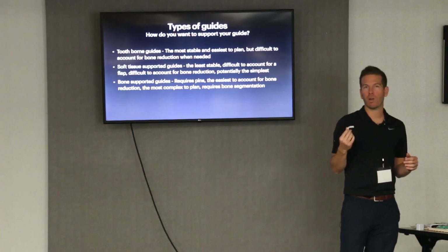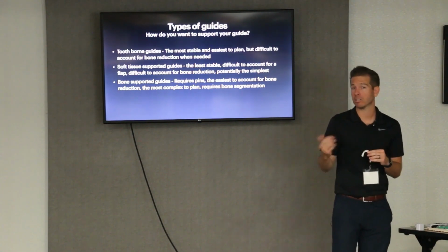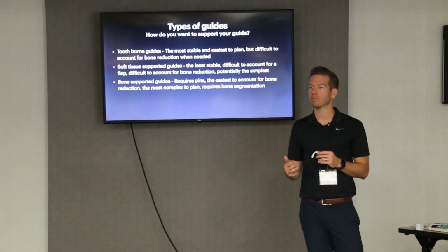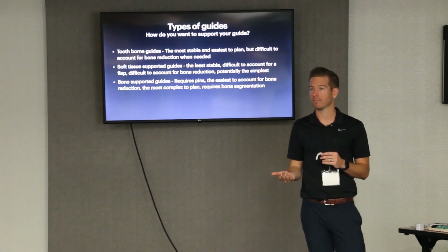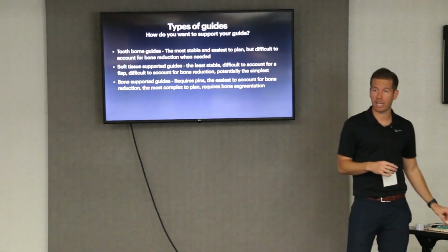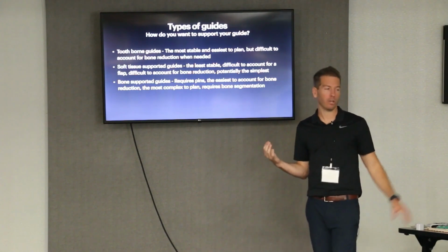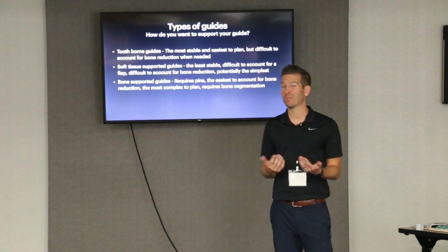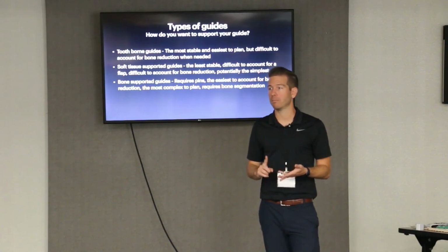We're getting to the point where that minimum reduction is becoming a little bit less because materials are getting better. Because the 15 to 18 millimeter reduction was built on an acrylic hybrid model. Zirconia too, right? Yeah, and pure zirconia only, the brittleness of those. When we talk about the temporary restorations and then the bulletproof restoration, you're just needing less and less, which is cool because you can tackle more cases, reduce less bone, keep things more simple.